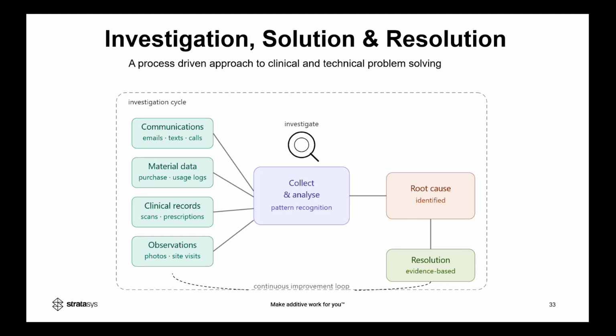Especially when you're experimenting with the new TrueVoxel, ensure that you do this as well, because that will really help us with photos and things like that when you're describing and giving us feedback.